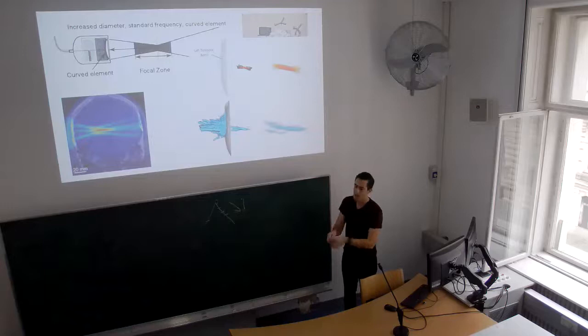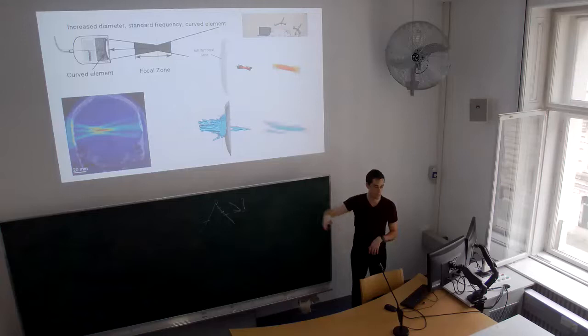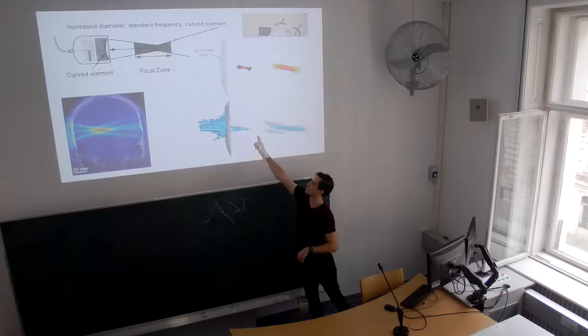But when you go through skull, it deforms the focus. It smashes it, makes it a little bigger, depending on how it's hitting the bone. A lot of the energy bounces off the skull and is absorbed by the skull. It might attenuate it by 50 to 90%, depending on a lot of things. And it tends to also refract it towards the head a little bit. So if you get a transducer of a certain depth, when you go through the skull, it's actually a little shorter. We'll get back to that if you guys want details on that.